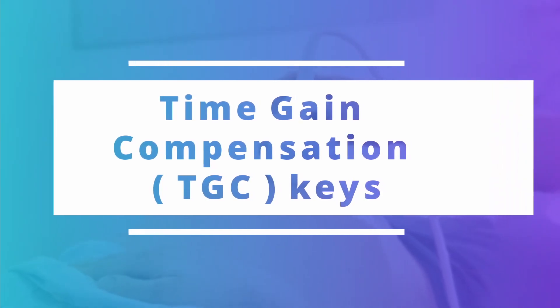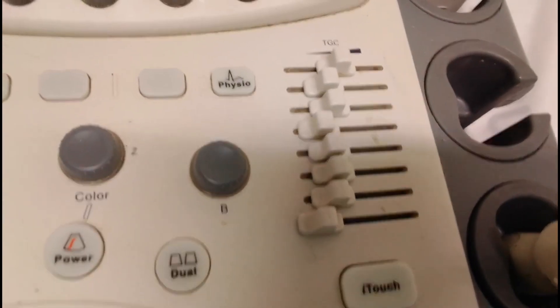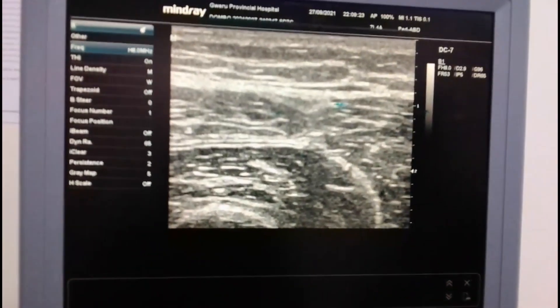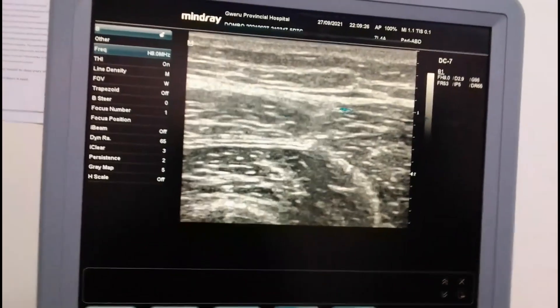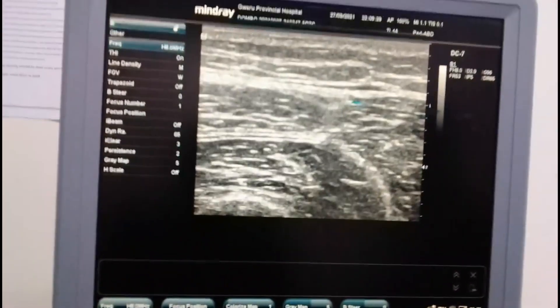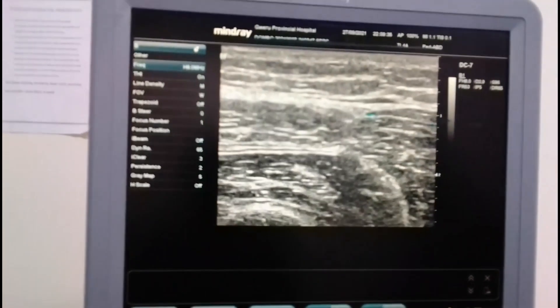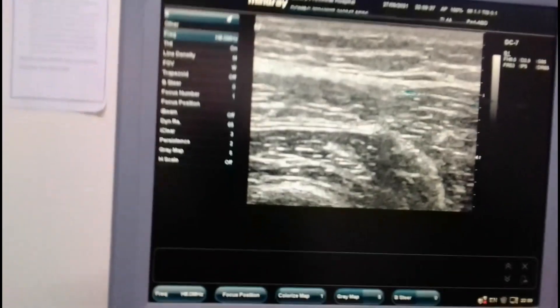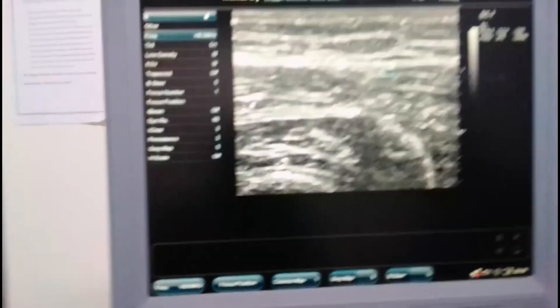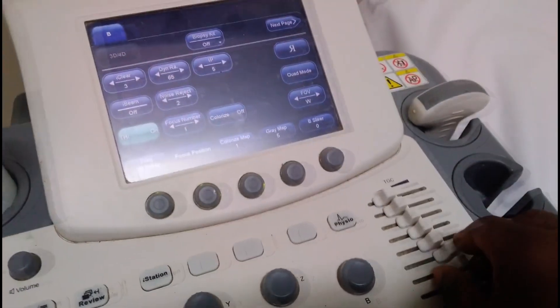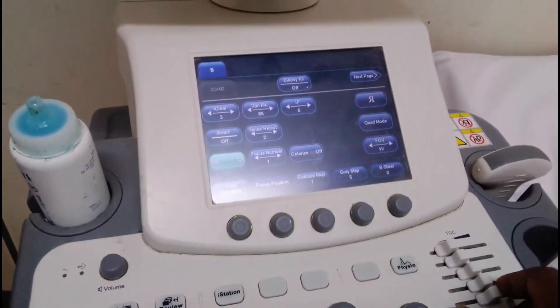Let me take you straight to the time gain compensation keys so you can actually see the arrangement of these keys. In this arrangement you can see what is coming on the screen — the image is almost homogeneous. The problem with time gain compensation is you don't have a fixed orientation that you are supposed to use to say that I am getting the best image. Structure varies from one structure to another in terms of key arrangement.